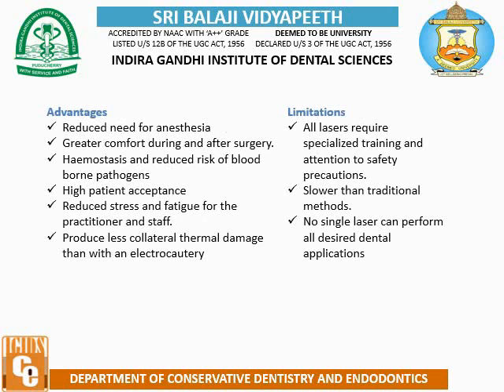Advantages: it reduces the need for anesthesia, greater comfort during and after surgery, hemostasis and reduced risk of blood-borne pathogens, high patient acceptance, reduced stress and fatigue for practitioner and staff, produces less collateral thermal damage than with an electrocautery. Limitations: all lasers require specialized training and attention to safety precautions, slower than traditional methods. No single laser can perform all desired dental applications.